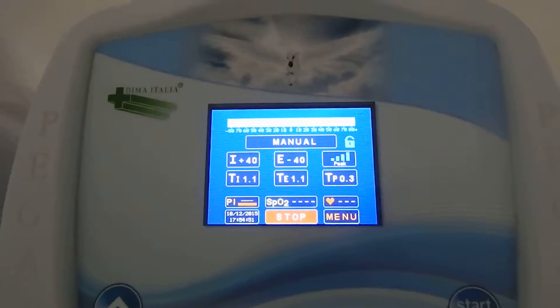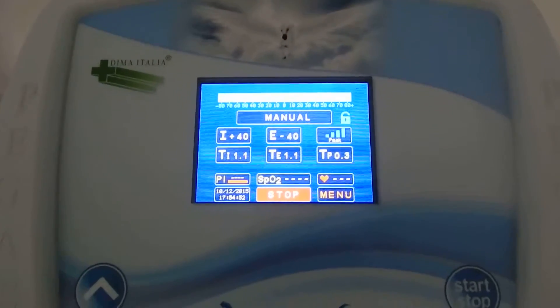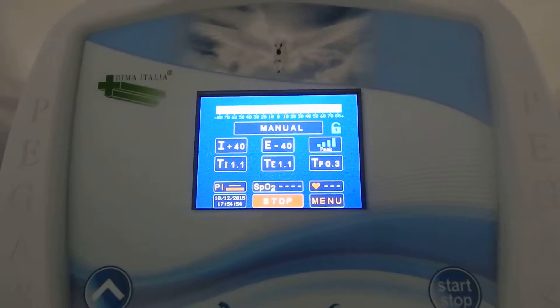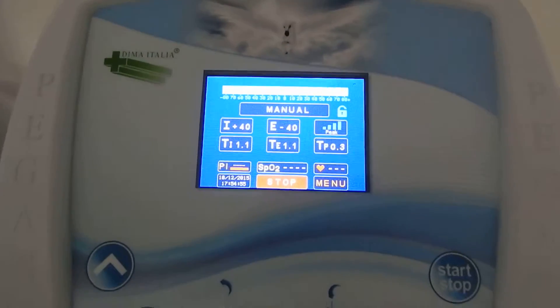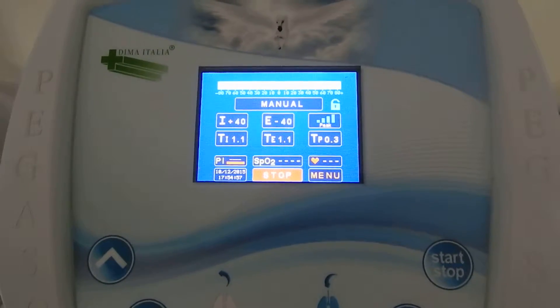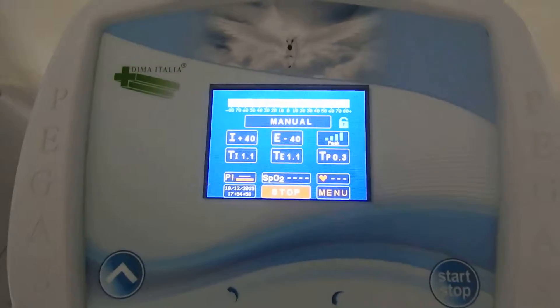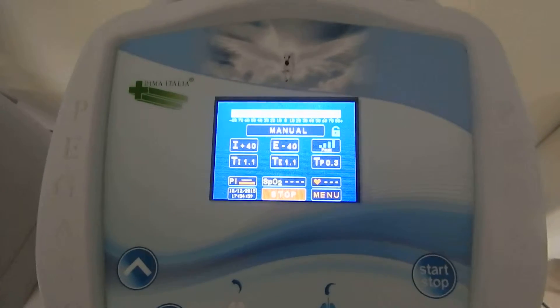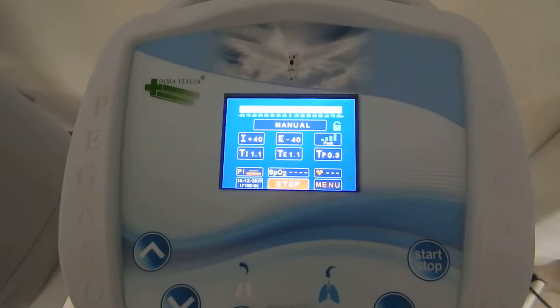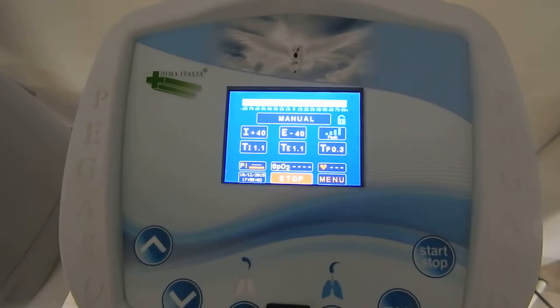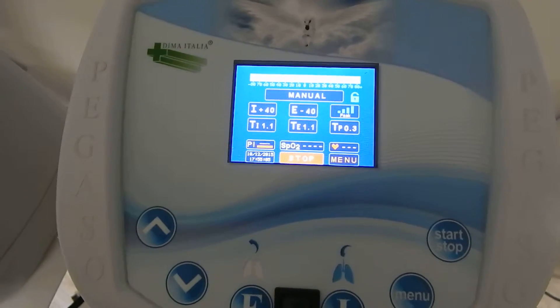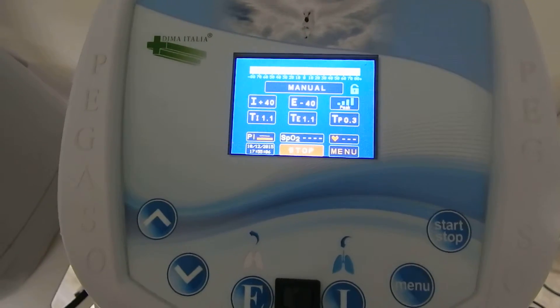Typically, we use the manual mode for a new patient that has to be introduced to the therapy. The PEGASO helps the physician to find the correct parameters and then store them easily in the automatic mode.